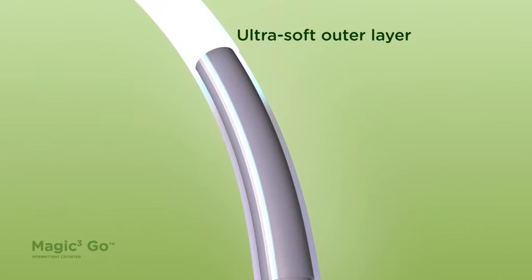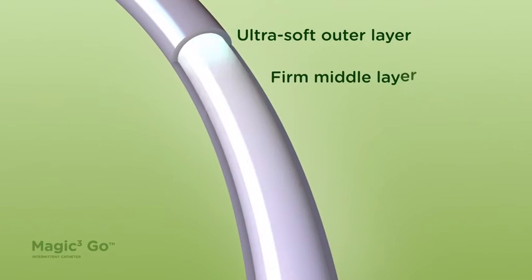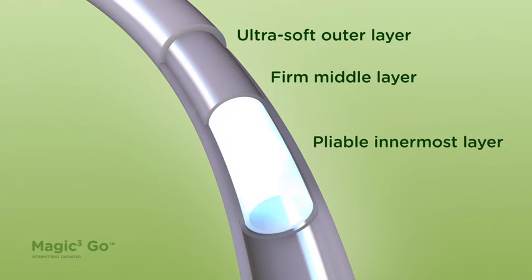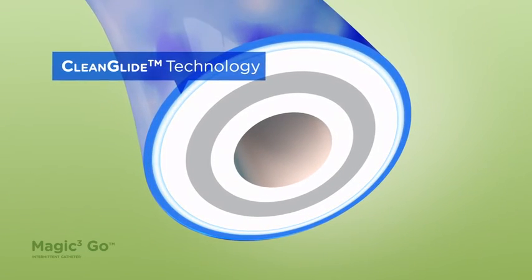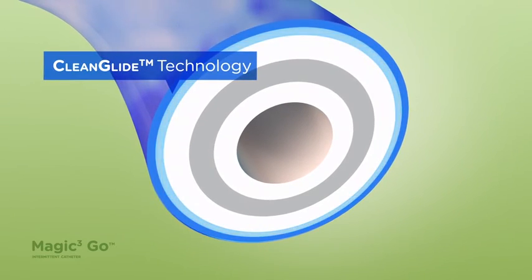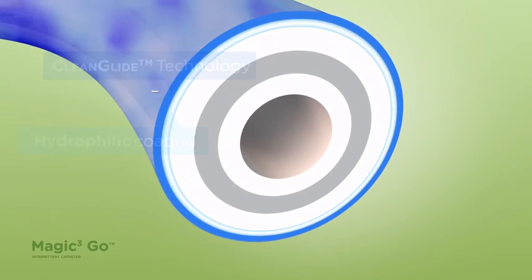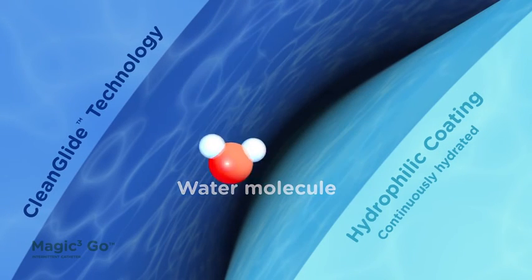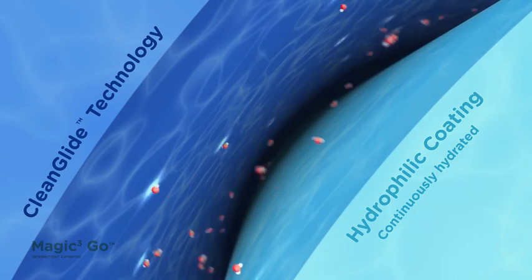The catheter has an ultra-soft outer layer designed to help maximize comfort, a firm middle layer for easier handling, and a pliable inner layer for easier navigation. Clean Glide is a next-generation lubricious hydrogel that is self-hydrating, maintaining the hydrophilic coating and the catheter in a hydrated state, requiring no patient activation with water prior to use, creating a virtually friction-free catheter insertion and removal.